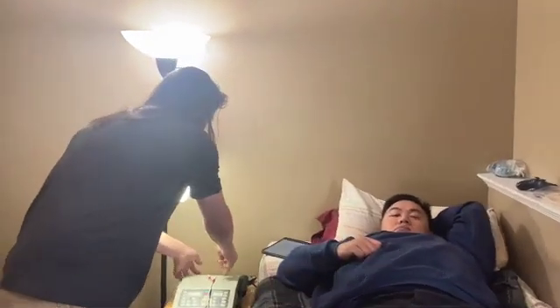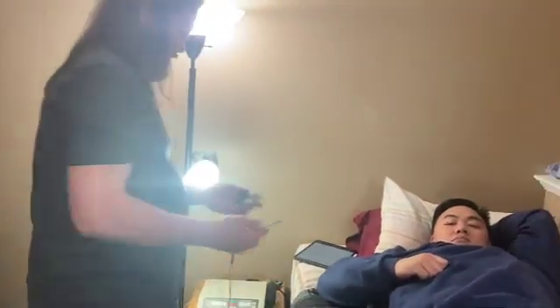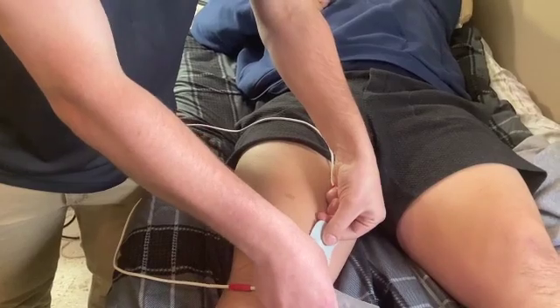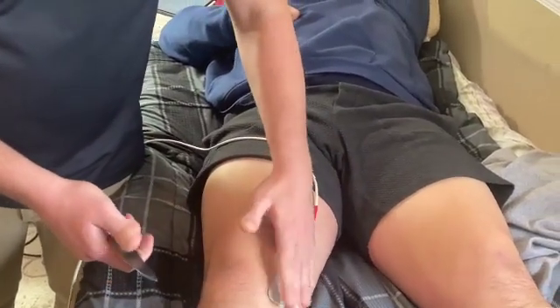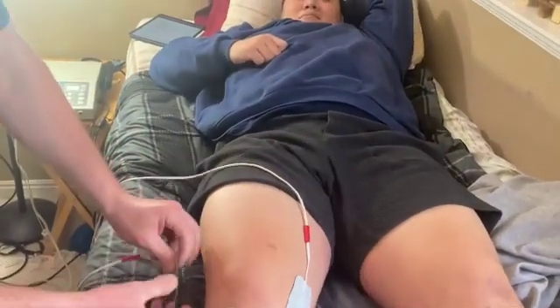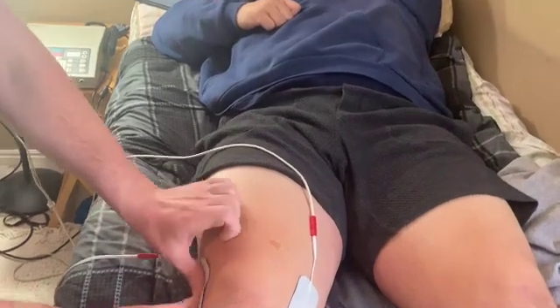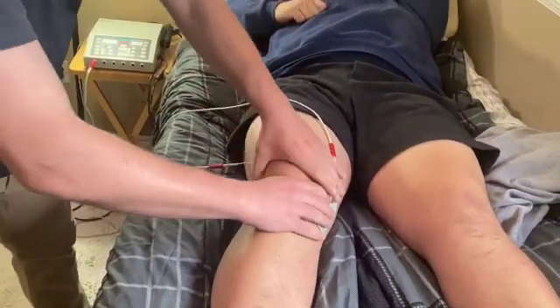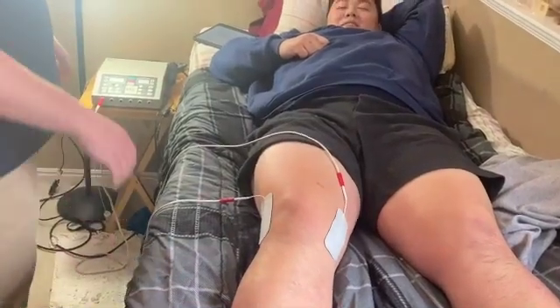Yeah. So I'm going to hook up the electrodes here. I'm going to put one on each side of his knee so that we can get the current to kind of flow through the tissues at the knee here. All right. And then we're going to come over to the machine and get it set up for this.